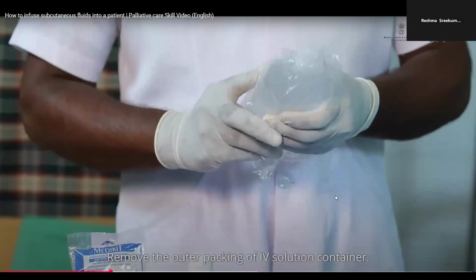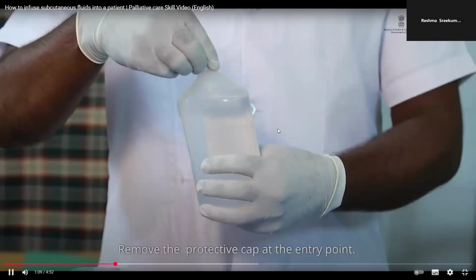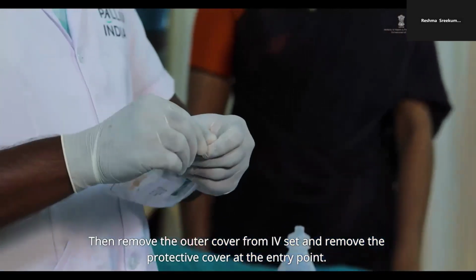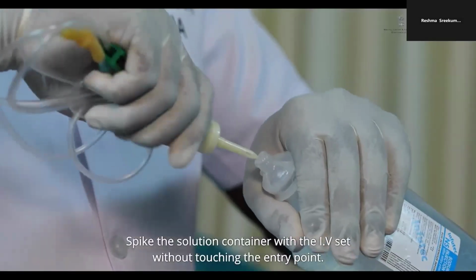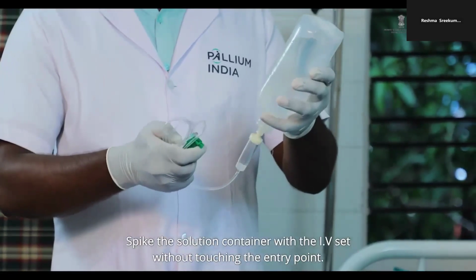Remove the outer packing of the IV solution container. Remove the protective cap at the entry point. Then remove the outer cover from the IV set and remove the protective cover at the entry point. Spike the solution container with the IV set without touching the entry point.